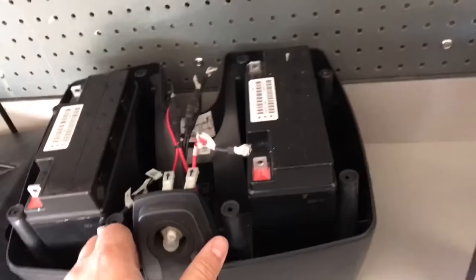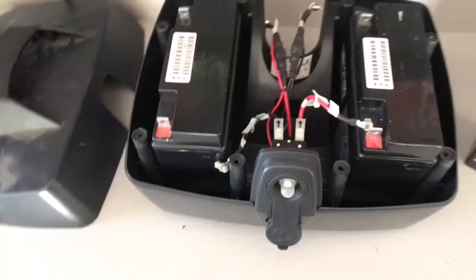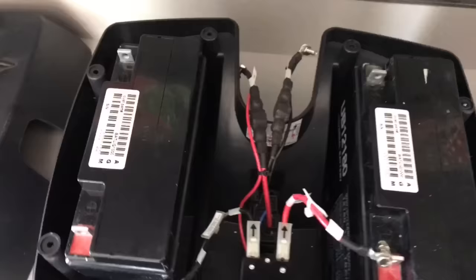Once you pull out your screws and lift that off, it's a pretty simple double battery setup. You basically have these little UB12180 batteries. If you were to try to buy the entire assembly, I think they're charging somewhere between $150 and $200 for the whole battery box — but you don't need to do that.